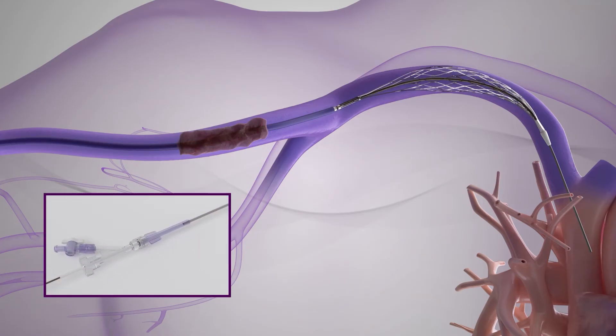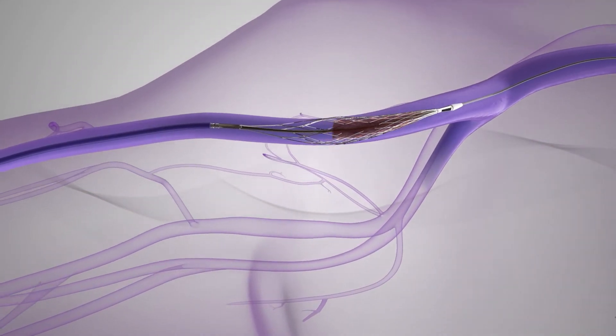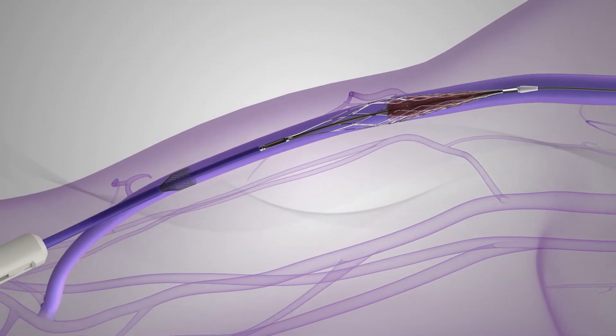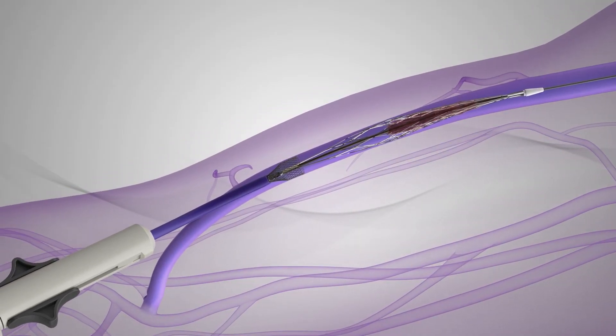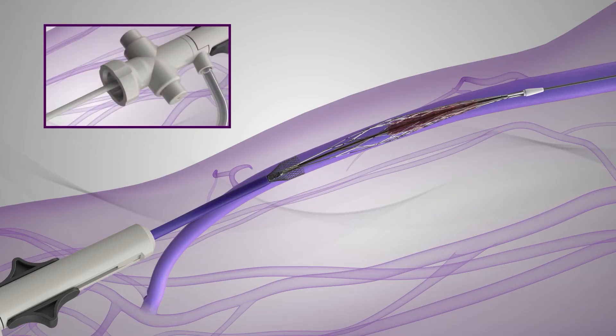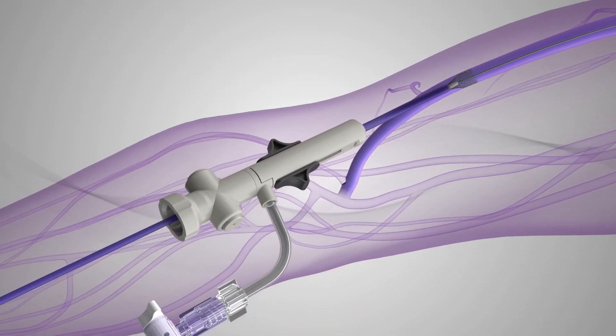Then, the rotatable hemostasis valve is tightened to secure the outer catheter to the inner catheter. The Inthril catheter is slowly retracted 1-2 mm per second until the catheter element's proximal radiopaque marker is aligned with the radiopaque marker on the sheath. Alternatively, the operator can confirm the element location inside the sheath funnel when the dark purple marker on the outer catheter exits the sheath. The Inthril catheter is removed while pressing the valve buttons on the sheath.